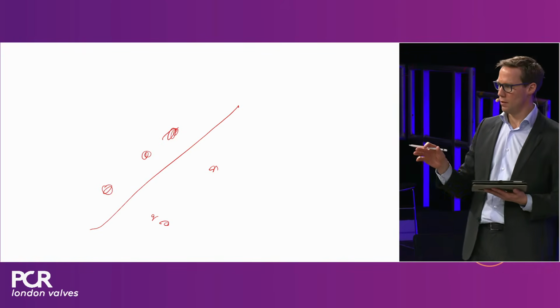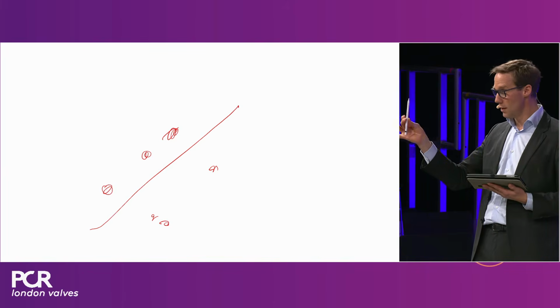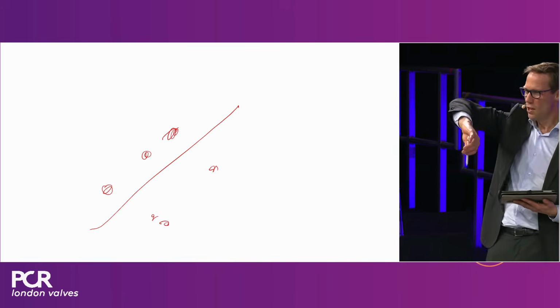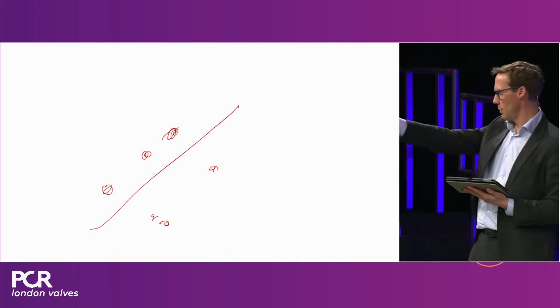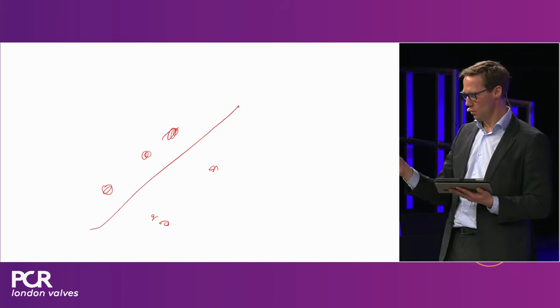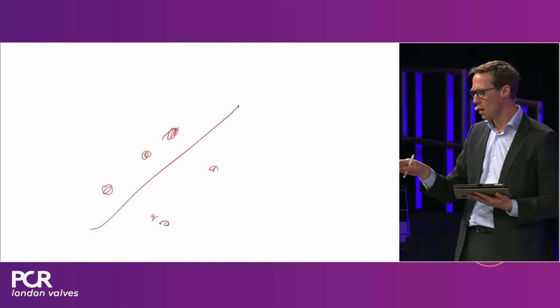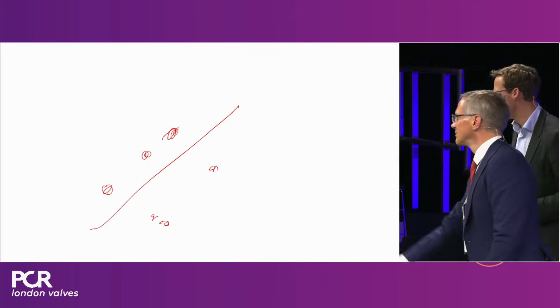I think the difficulty is that, of course, with this system, even though it's much easier to align, as I mentioned, it's a really nice feature. With this kind of hostile anatomy, as you take it around the arch, you are going to have a little bit of rotation of the system. And like we spoke about with that gentleman, you have a choice. Your choice is to take it back and to do it again. But I think with this type of anatomy, awesome result with mild to moderate commissural misalignment. I would take that personally.